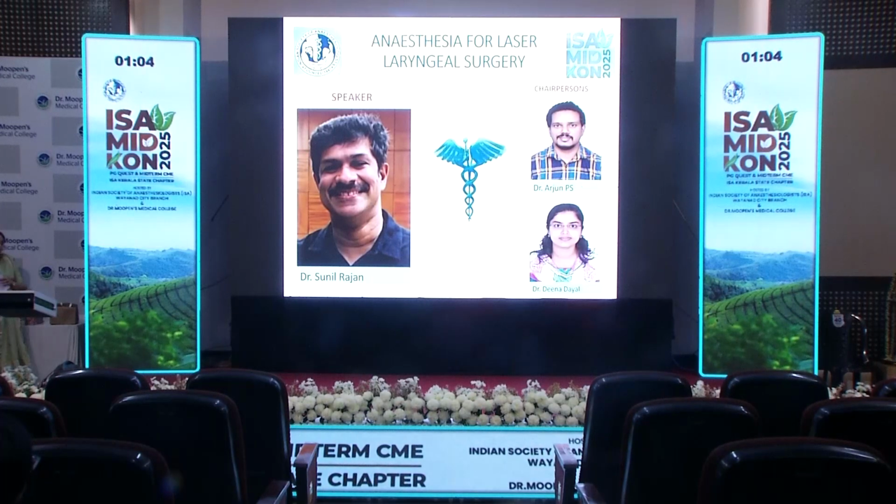Sir, is there any difference in the outcome if you are using conventional and laser? Have you observed something? My question is because we are more towards laser, right? Is it being forced upon? No. The patient outcome will be better because there will be less bleeding, morbidity will be less, surgical time will be less. Overall, the patient outcome will be better if you go for a laser surgery.